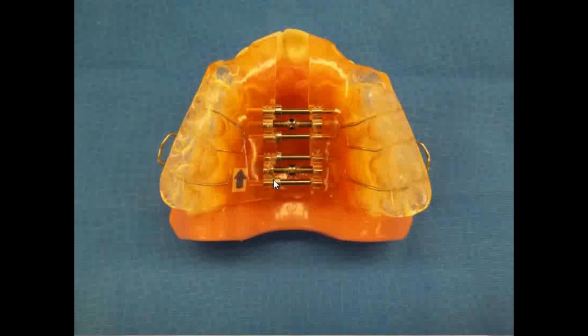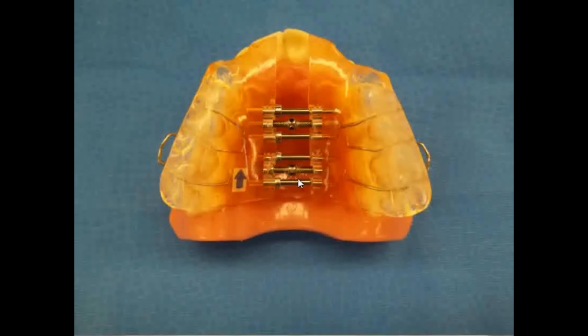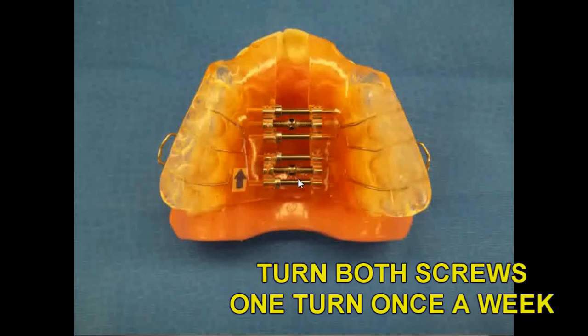We use the same 8mm screws for the transverse appliance. Each turn is a 1/4 millimeter. The patient should turn both screws one turn once a week. This slower schedule will prevent the teeth from tipping and help you achieve a more stable result. It will take 5 to 6 months to open the screws all the way.